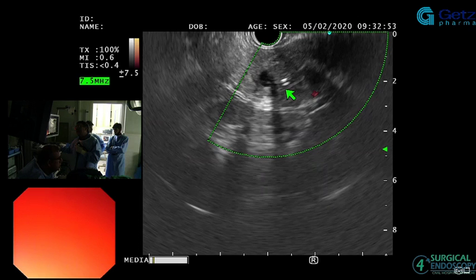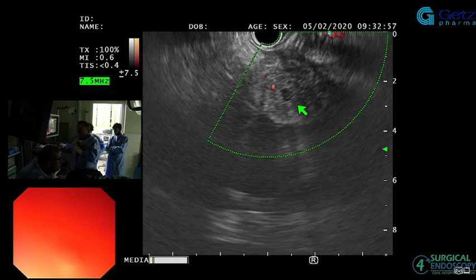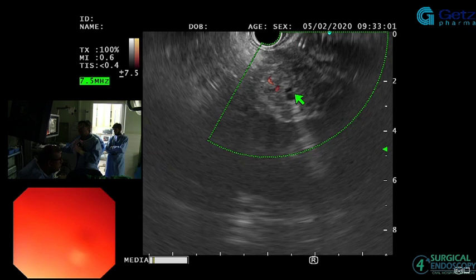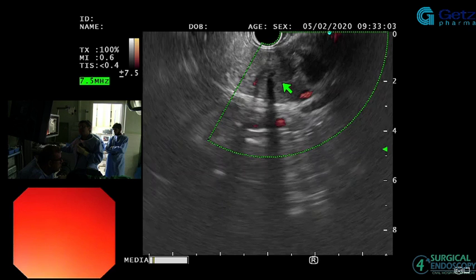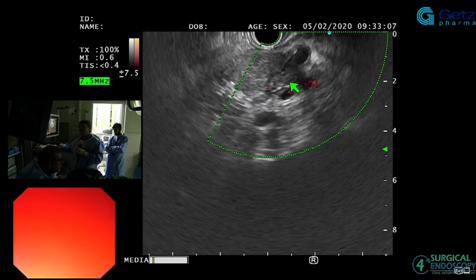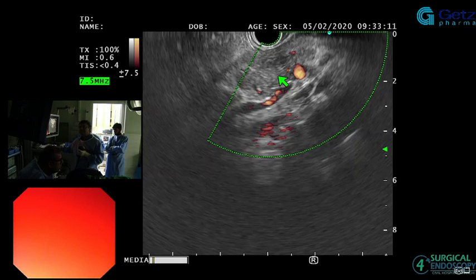That's the question for the audience. Sadbhai knows that. So what would you do now? She's got the cyst basically gone almost, and she's asymptomatic. She's fine. Do we take these stents out or do we leave them? Is the question.